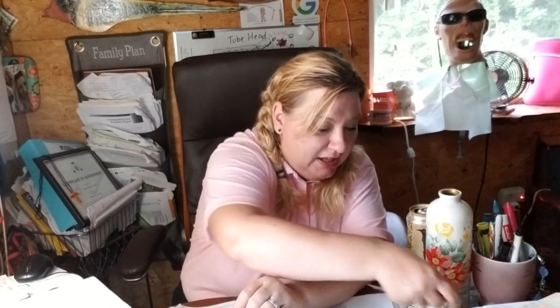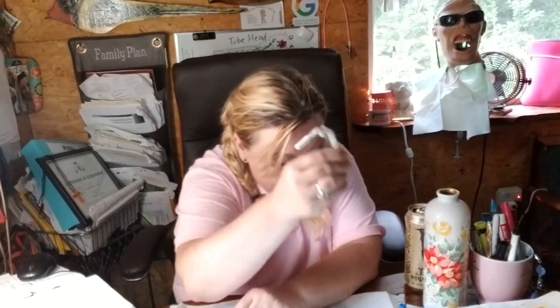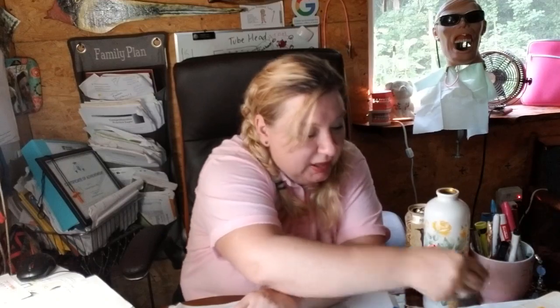And it's just like the colors on the ring kits. You've got blue for anterior, yellow for posterior, and then you've got red for bitewing, okay? And then it has the arm on it. That way you can keep reusing these if you have a sleeve over it, and then just throw the sleeves out. I love those. It took me a minute to like them. There are also snap arrays. They look like little alligators.